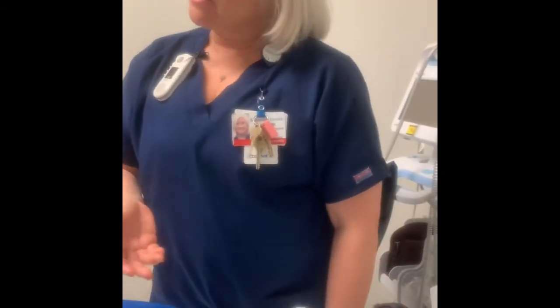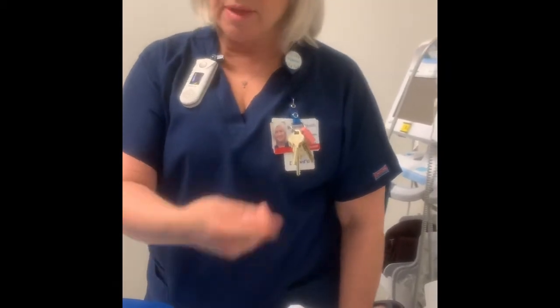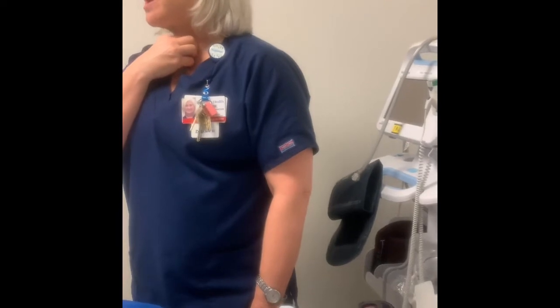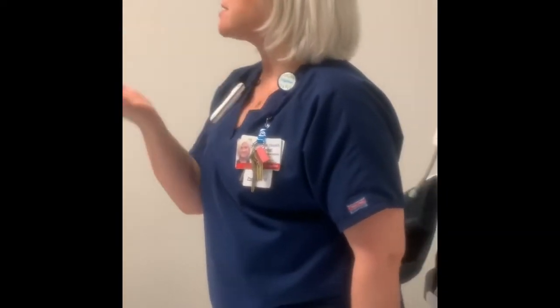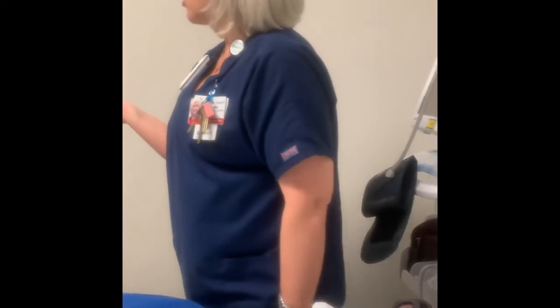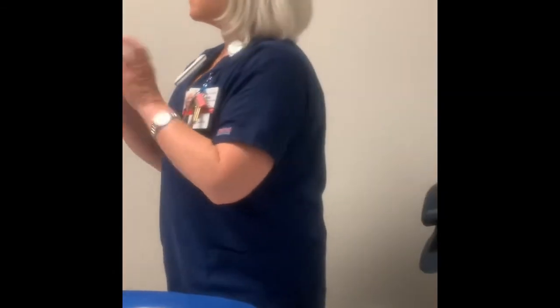So you know they've got a laryngectomy, but they may come in with still a temporary trach, okay? Or they'll come in with just a laryngectomy and they have their stoma, but they're not putting their Larry tube in. And a lot of times when I see patients that come in with Larry tubes, I'll ask them in the hospital, I need you to bring your Larry tube. Where is it? Well, they'll usually tell you it's in the trunk of the car. What do you call it, a Larry tube? A laryngectomy tube. It's just a small, little, tiny curved tube. Oh, that thing that they slip in there. Yeah. Okay. And it helps keep that stoma stable.